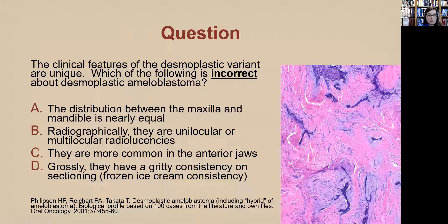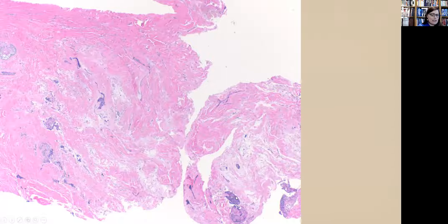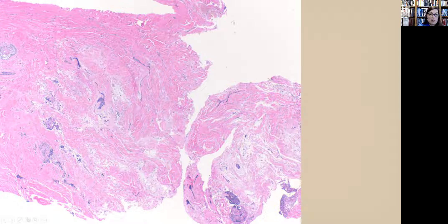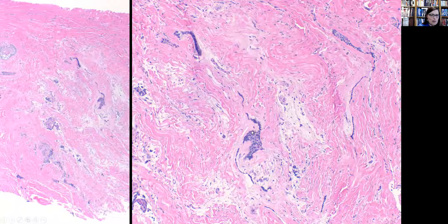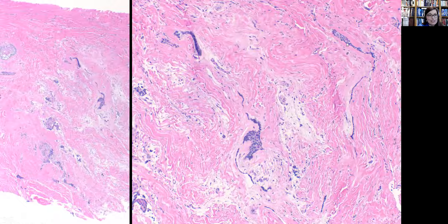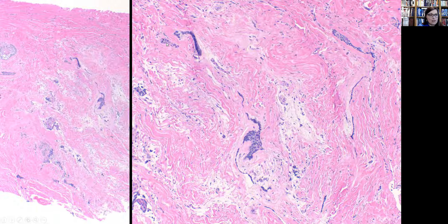This is an example of desmoplastic ameloblastoma. The islands of epithelium are somewhat crushed, and we see a blue myxoid appearance in the stroma surrounding the islands. They are stroma-rich and epithelium-poor, though if you look carefully you can find a more classic follicular island somewhere within the lesion. These are among our more tricky ameloblastomas, and they also don't have that classic radiographic appearance. At higher power you can see some peripheral palisading, but it is certainly not as classic.